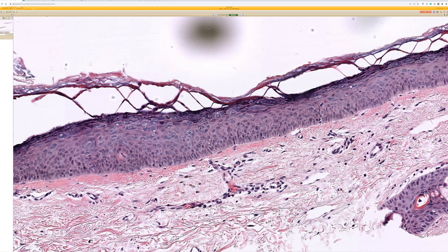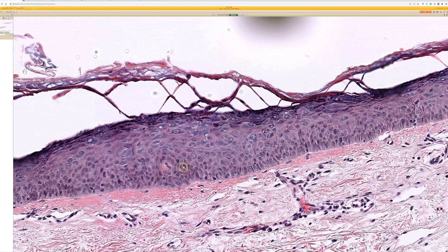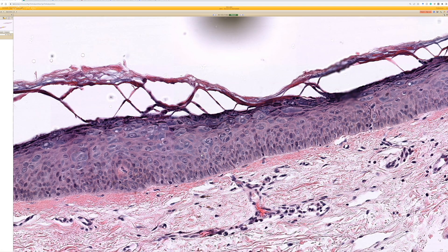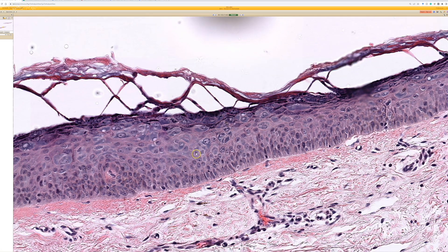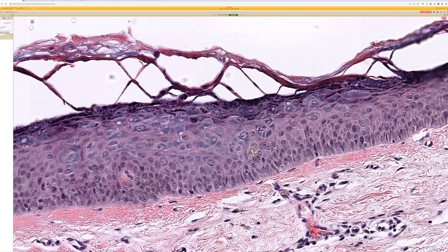I've only seen a couple of cases of real germline epidermodysplasia verruciformis in my practice, but we see this finding incidentally as little tiny incidental foci in the skin of older adults next to skin cancers all the time. I don't even usually mention it when it's just a small incidental focus — it's just a small finding that we see on a relatively regular basis. But it's good to know about for those cases, so when you see this, you know what it is.